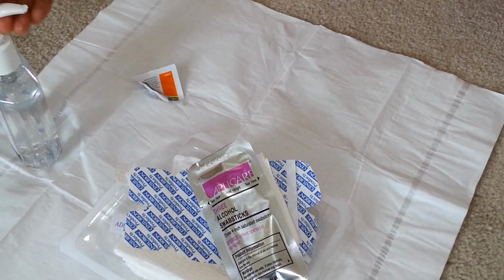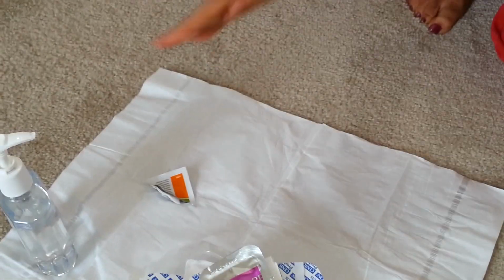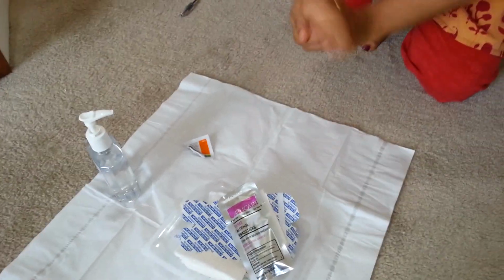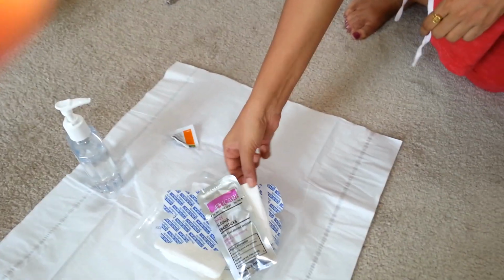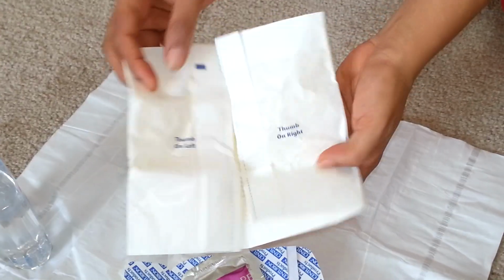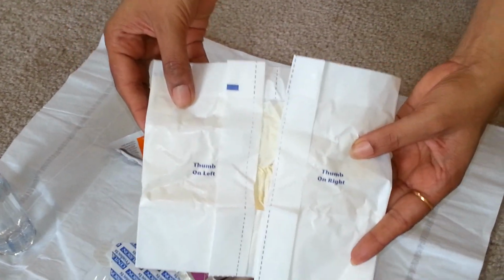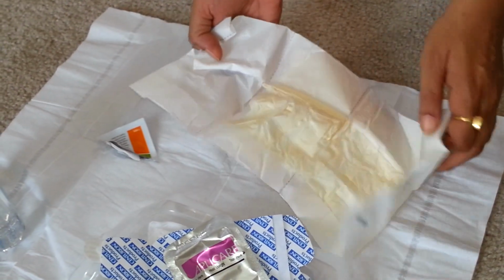My family member will now put on the sterile gloves that are available in the kit. When we open the package, the gloves are marked for the right hand and the left hand. They are supposed to be worn in a way so as to not touch the outside surface.